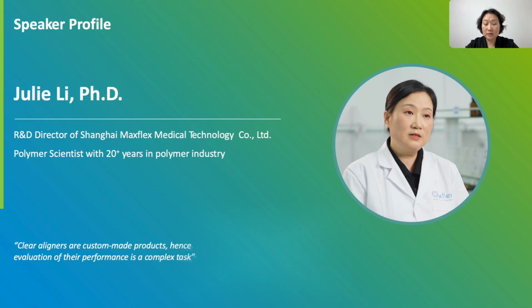Phase 2, after the treatment starts. In other words, to assess the treatment progress and outcomes. The assessment is mainly done by orthodontists.